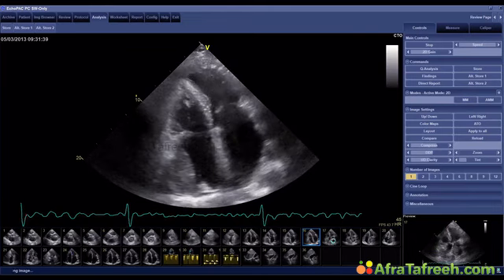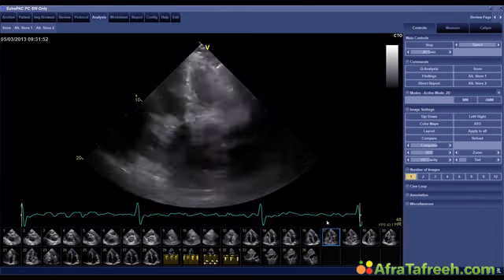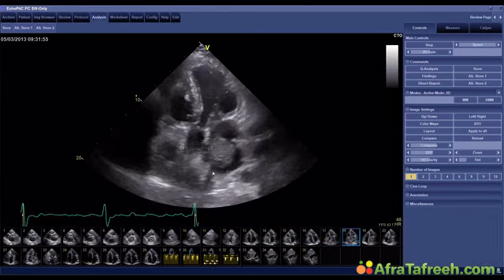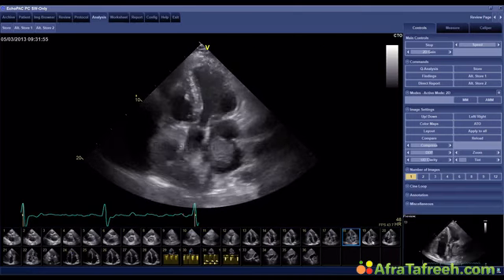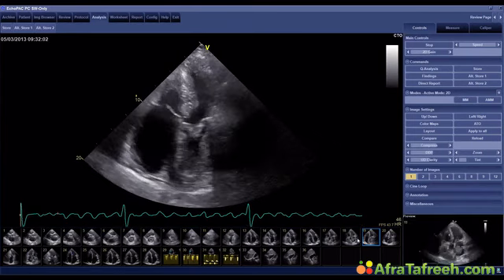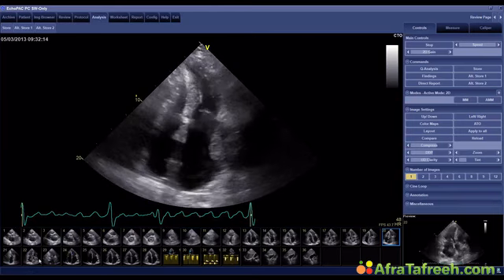But this is not the only finding in this patient. We also found something here in the left atrium. Again, twisting back and forth, you can now see that there is also a thrombus here in the left atrium. All those who were with us in the last webinar probably remember this case.